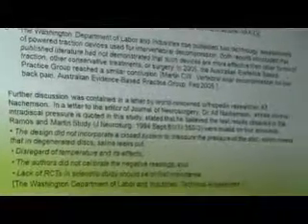The Washington State Department of Labor and Industries concluded, in two technical assessments on the effectiveness of traction using intervertebral decompression, that the published literature has not shown that such devices are more effective than any other type of device we use. Also, the classic Ramos and Martin study, where they stretched on the table and pulled, found a precipitous drop in pressure, and that's supposedly unique to that table.